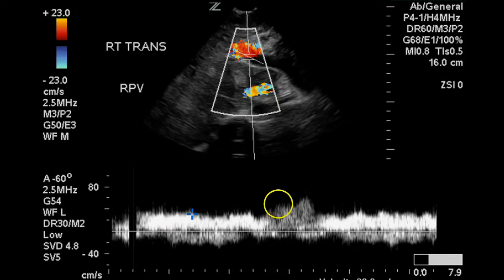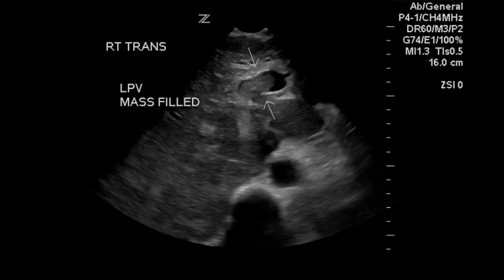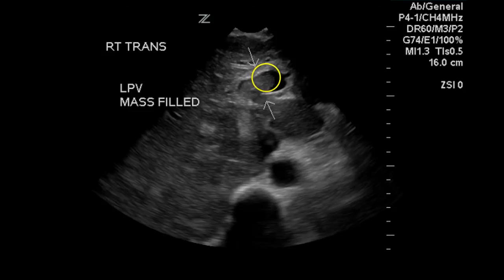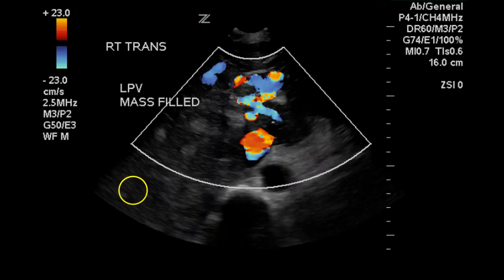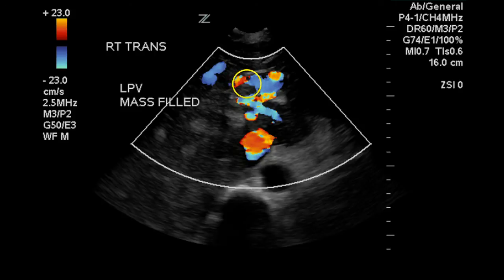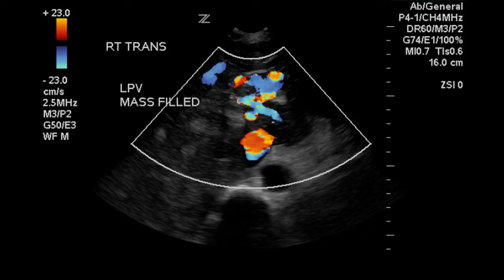There is some mild phasicity, which is normal in a portal vein. This is the left portal vein and it is filled with solid material, likely to be thrombus, although it could be tumor invasion. Color Doppler demonstrates no flow in the obstructing area, making it more likely to be thrombus.